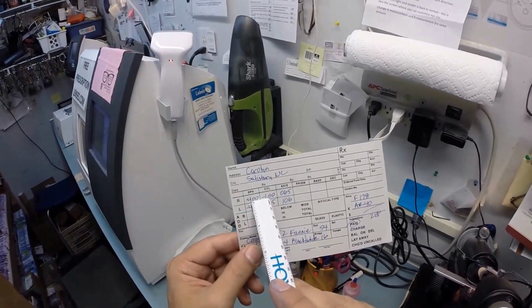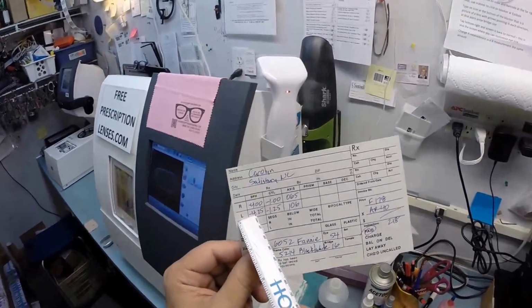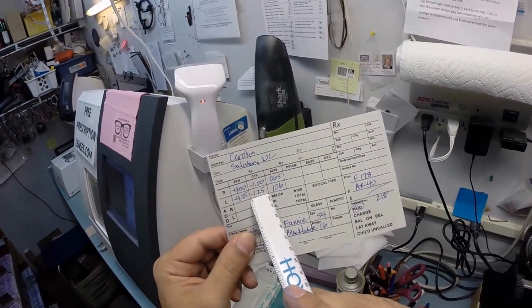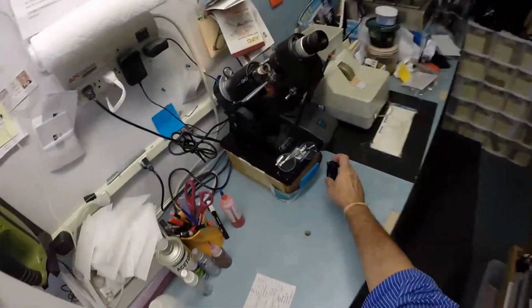So we have a combined value of -5 for your right eye, combined value of -5.50 for the left. So you need one step stronger in your left eye and one additional step of astigmatism correction to make everything that much crisper. That's why straight lines are a little bit better. Straight edges.